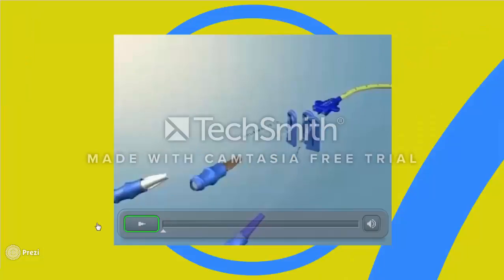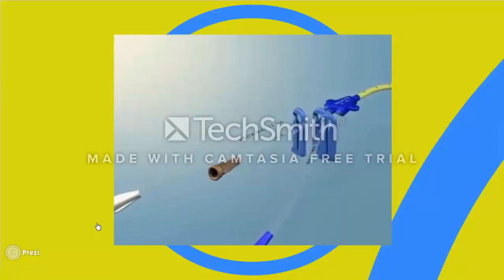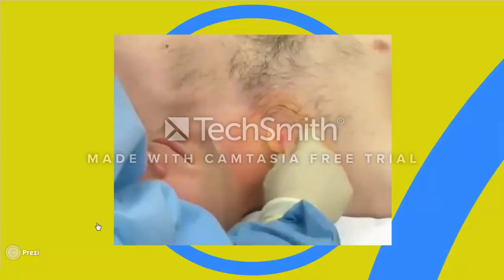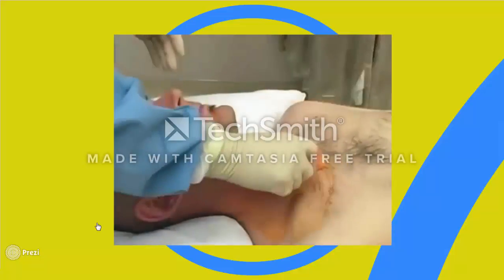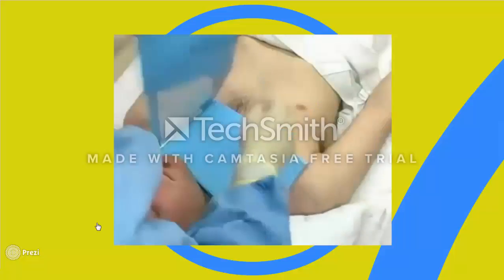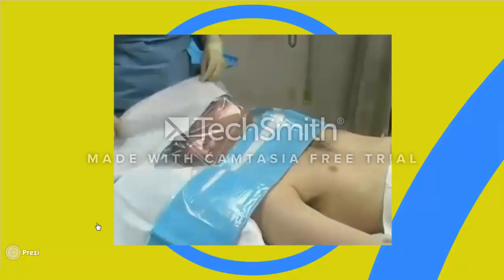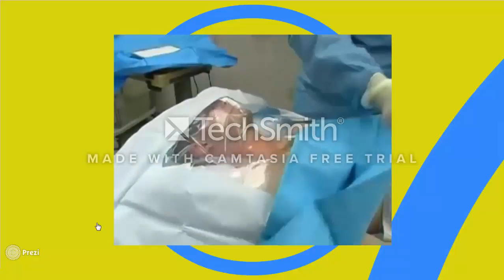Distal port removed so that the guide wire may be advanced through it. Cleanse the skin overlying the entry site with the chlorhexidine applicator, covering a wide region. Place the sterile fenestrated drape over the procedure area. Note that a large full-body drape should be utilized to reduce the incidence of iatrogenic infection.